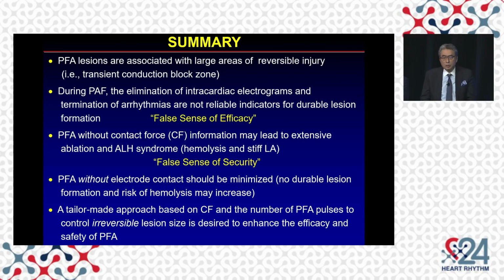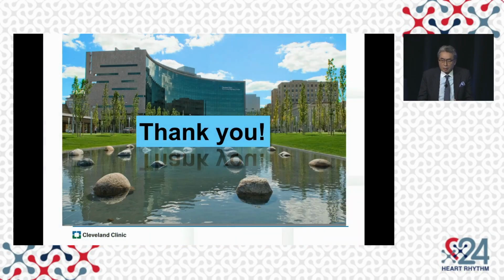of security issue. PFA without electrode contact should be minimized because it is not making a durable lesion, but the risk of hemolysis may increase. Finally, the tailor-made approach based on the contact force and number of PF pulses to control irreversible lesion size is desired to enhance efficacy and safety of PFA. Thank you.